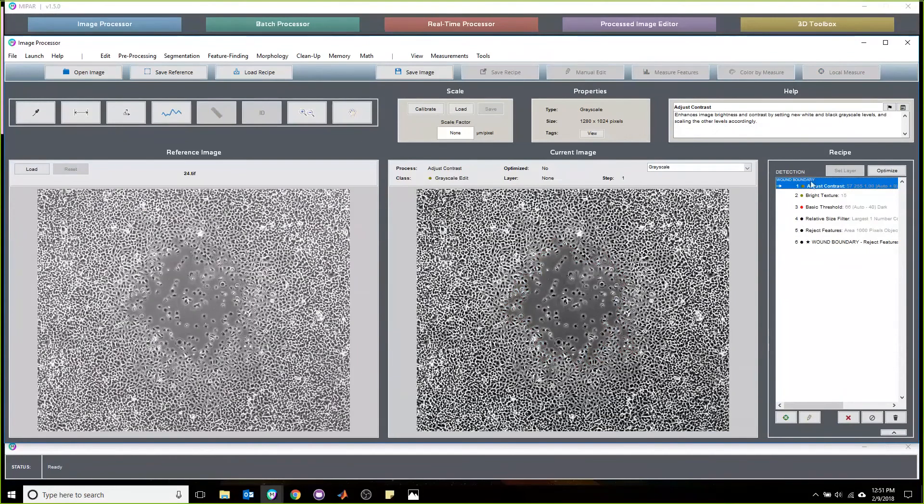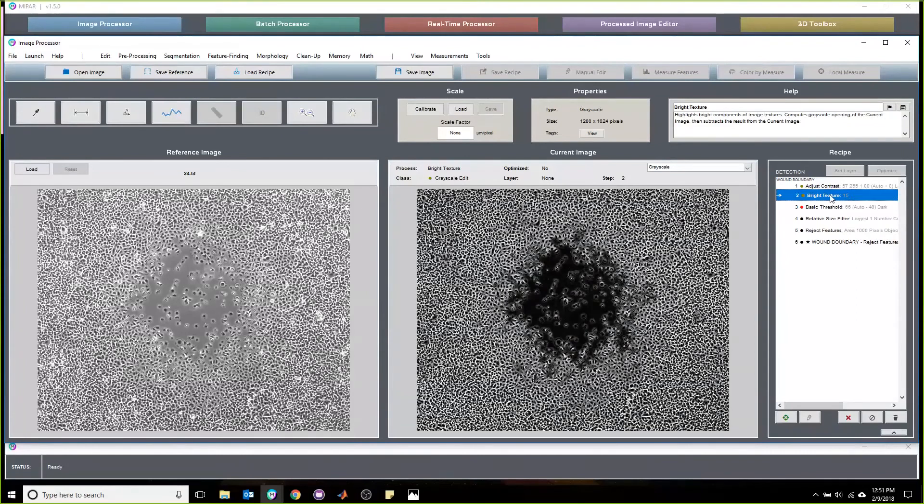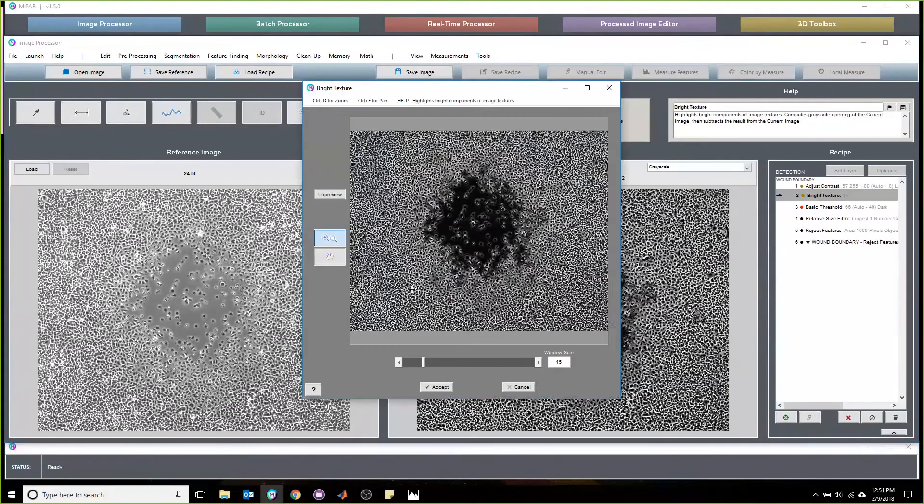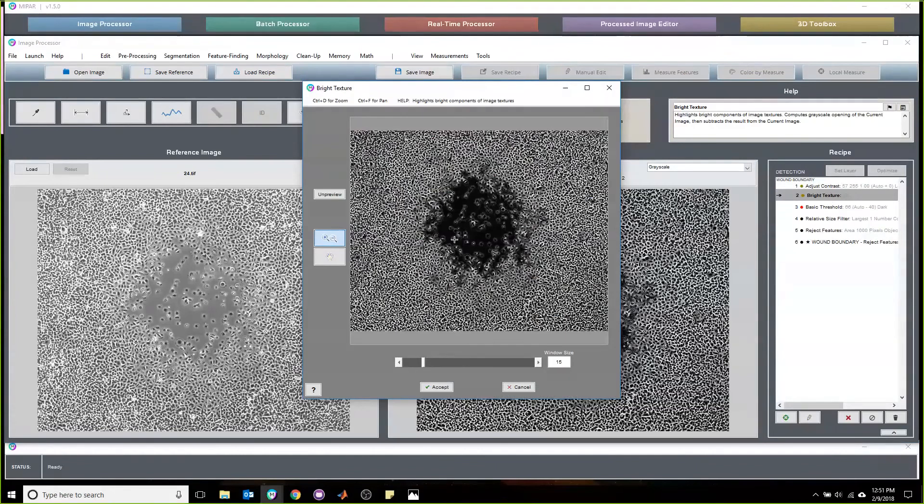The first thing we do is adjust contrast to make sure the levels are consistent enough for the bright texture algorithm to run. This is incredibly powerful because it brightens regions that have bright texture in them and then darkens the regions that do not. This is useful to us because we know that the wound itself will not have a lot of texture in it, but the cells will.